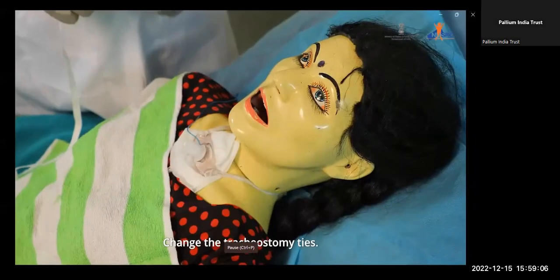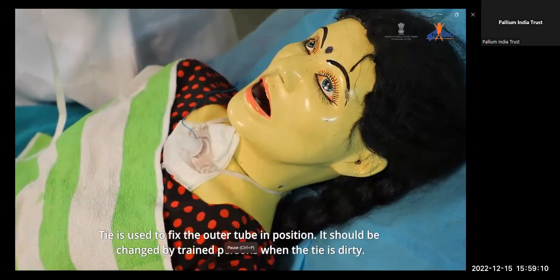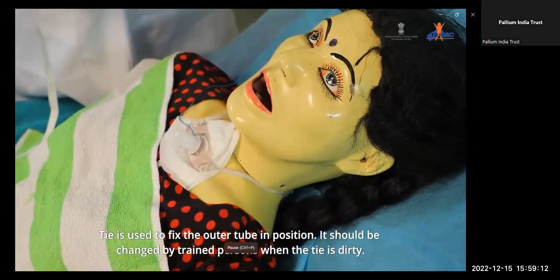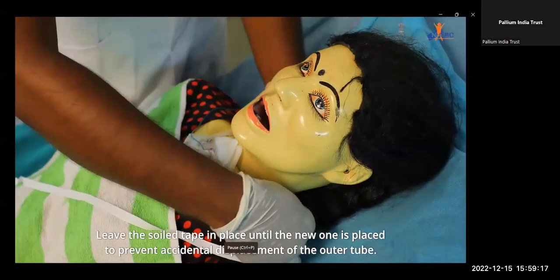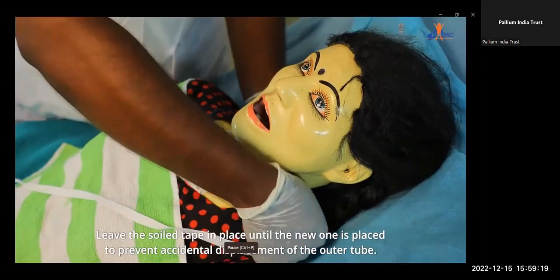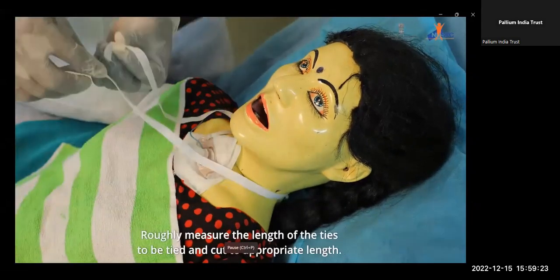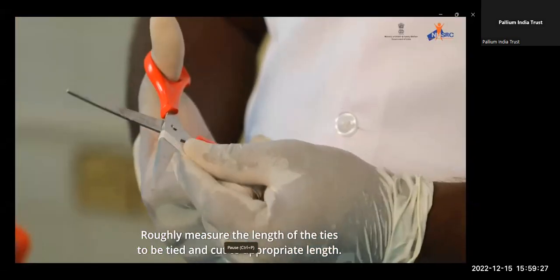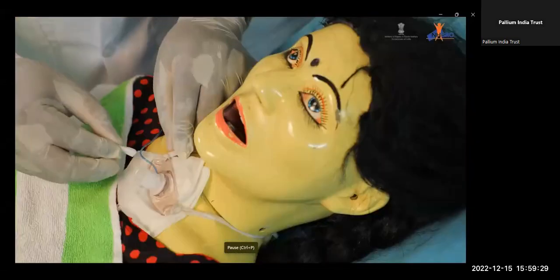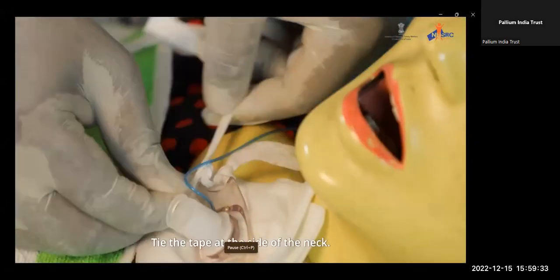Change the tracheostomy ties. Tie is used to fix the outer tube in position. It should be changed by trained persons when the tie is dirty. Leave the soiled tape in place until the new one is placed to prevent accidental displacement of the outer tube. Roughly measure the length of the ties to be tied and cut to appropriate length. Apply the new tape. Tie the tape at the side of the neck.